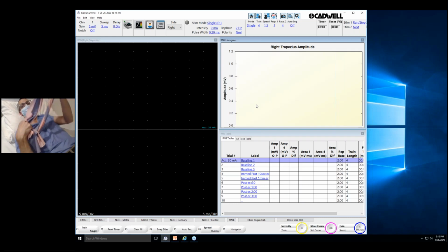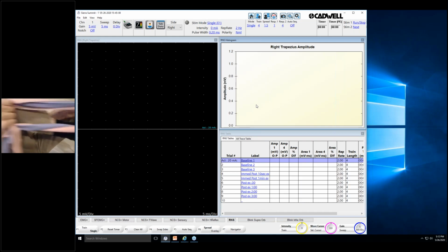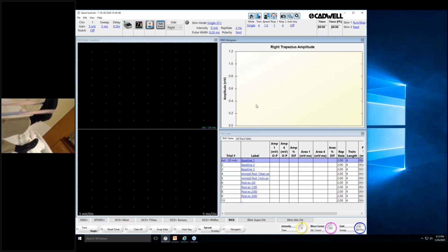We have bands that we sometimes use. So these are just those exercise bands. And what you can do is put this around the patient's foot, and then they can grab on. You can't really see this, but I'm grabbing on here. I'm grabbing onto this, and I'm keeping my arm straight, but I'm going to use these bands when I exercise. I'm going to shrug my shoulder up by keeping my arm straight. You can point it towards here, towards my shoulder. So I'm going to shrug my shoulder up to exercise.